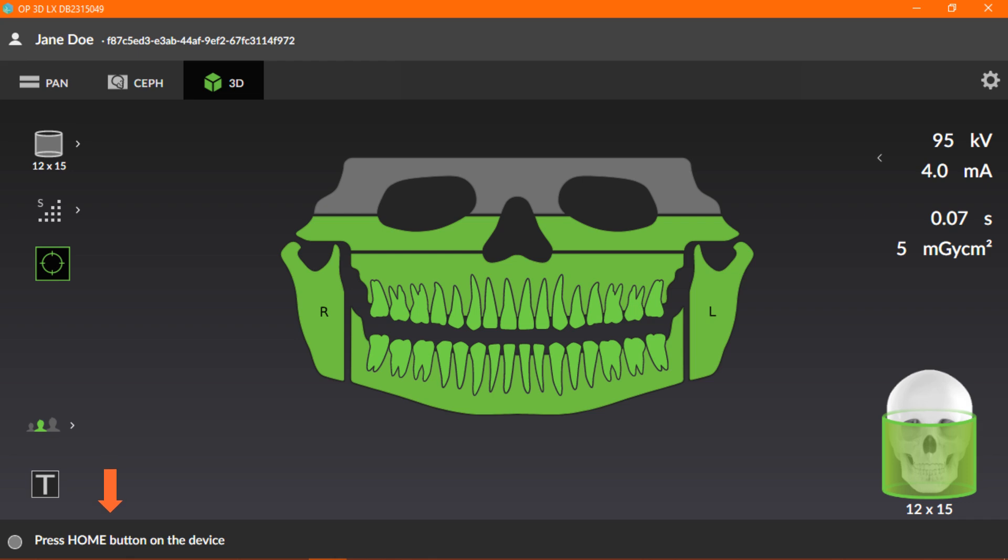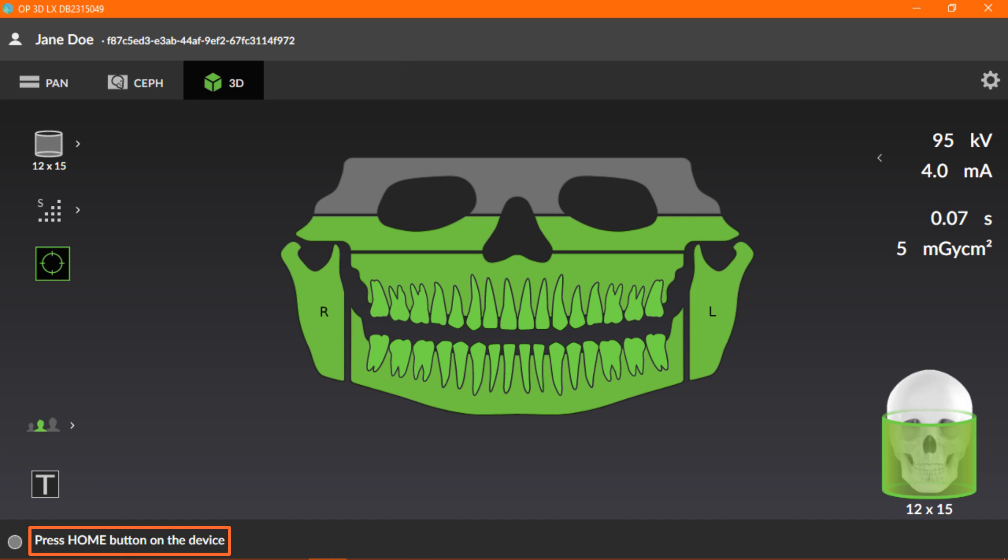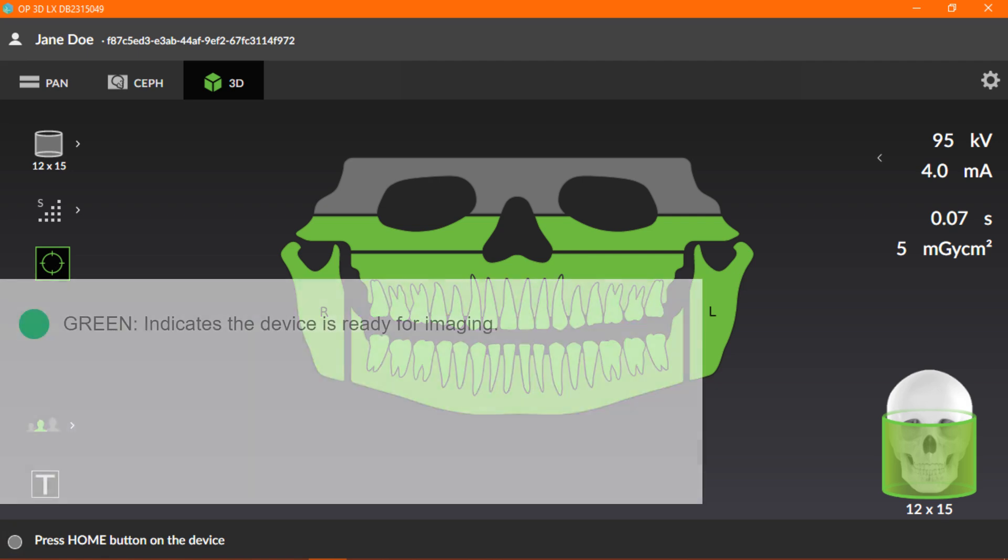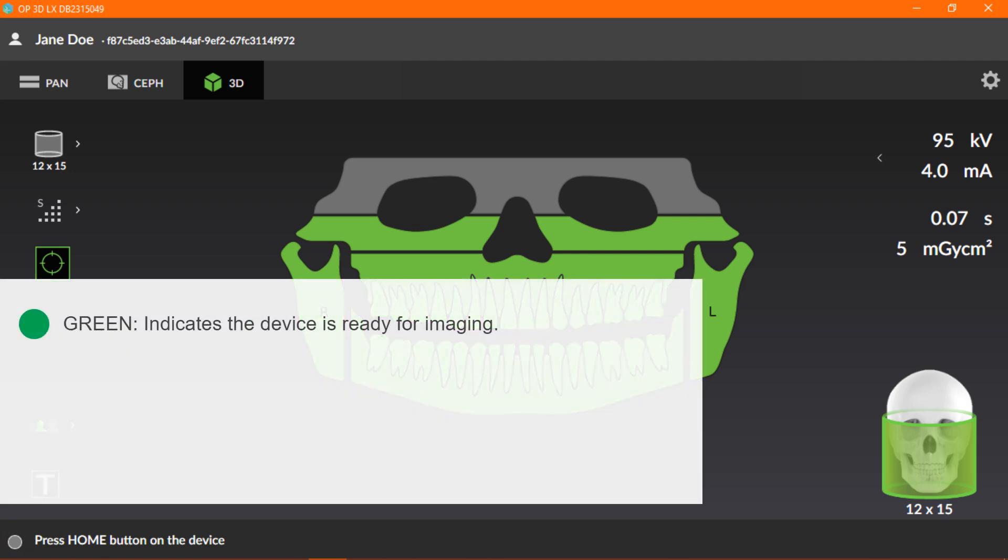The message bar and the device status indicator. The message bar provides messages and guidance to the user. The device status indicator shows the status of the device with a colored indicator. Green indicates the device is ready for imaging.